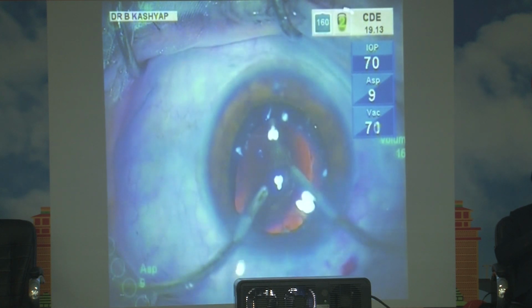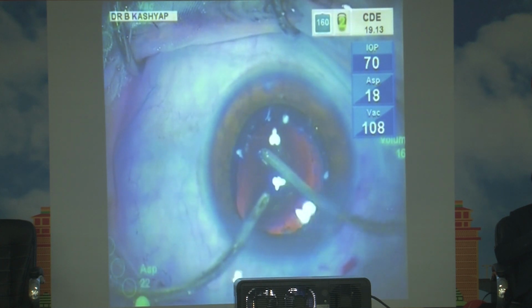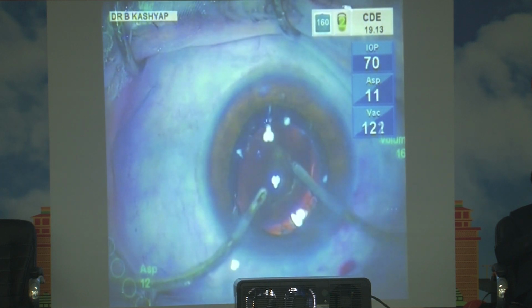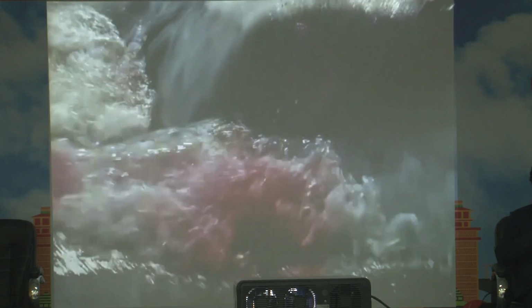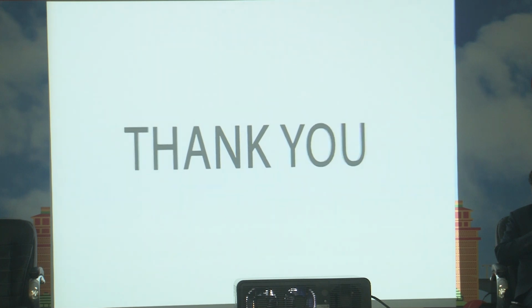So cataract surgeons are really in need of a variety of techniques in the armamentarium to deal with these posterior capsular plaques. This handy technique can be used in the arsenal of the anterior segment surgeon for getting rid of the posterior capsular plaque, and it is very easy for any anterior segment surgeon to go through the side port to the pars plana route and do a little vitrectomy and remove it. With the vitrectomy probe you can do it.